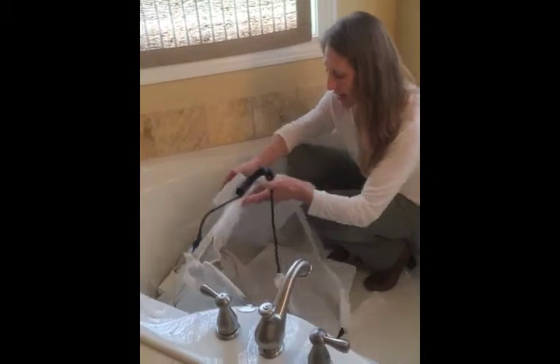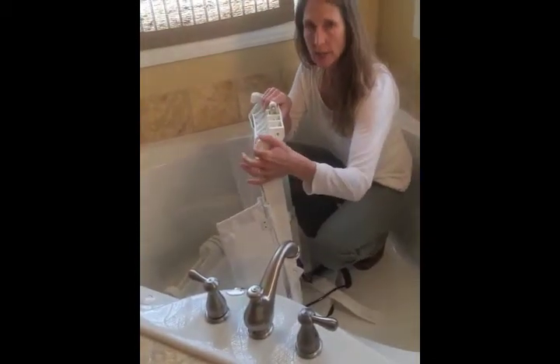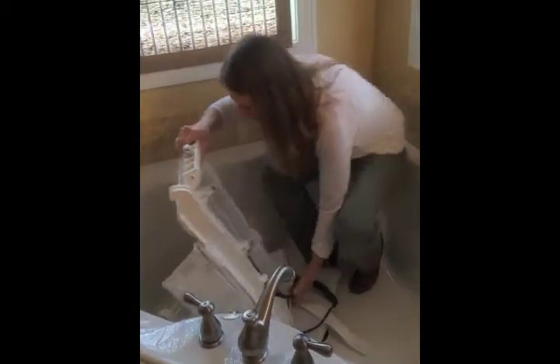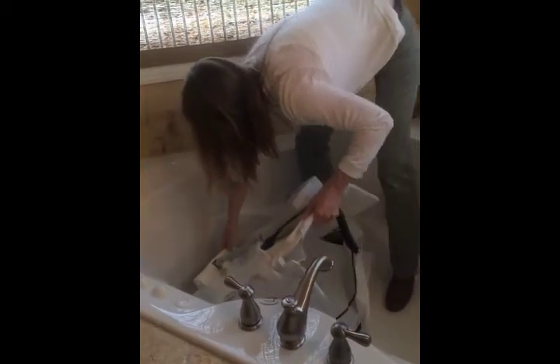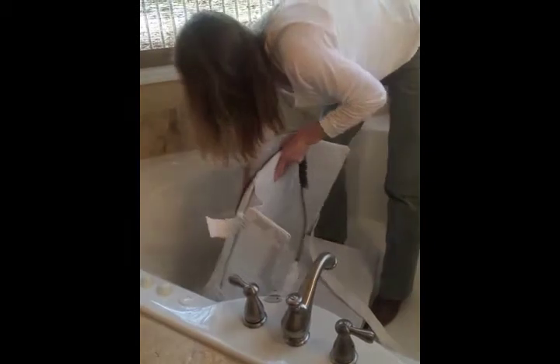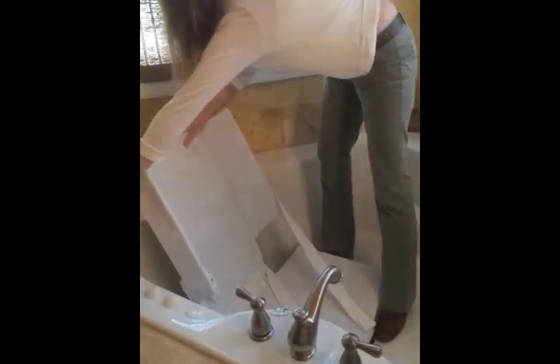To put these bath seats back together, it's really quite simple. There are notches on the back, and you just line them up in the grooves and push it all the way back.